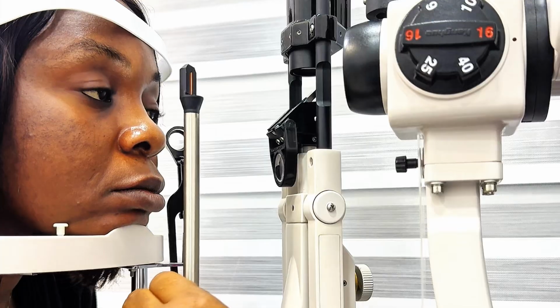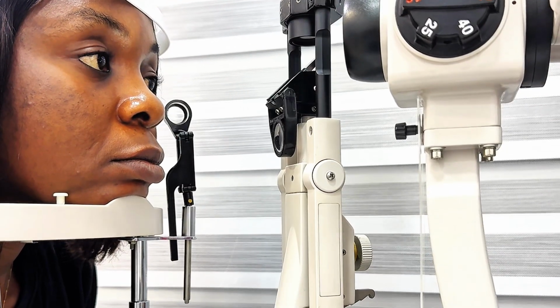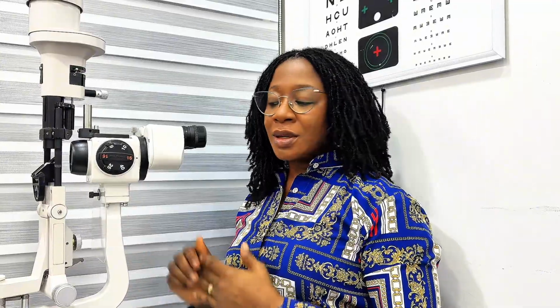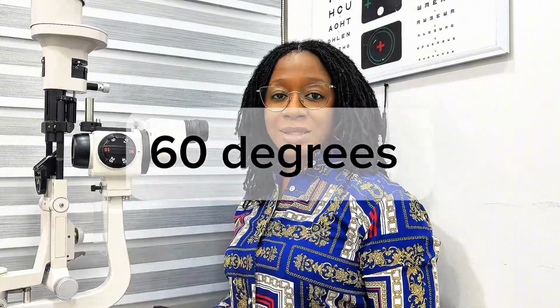So you make sure you explain the procedure to your patient. While performing any slit lamp technique, you should be looking at three things: the angle, the illumination, and the magnification. For the Herick technique, our angle is going to be set at 60 degrees.